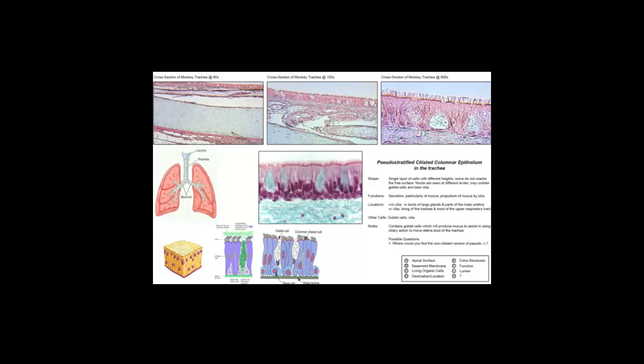Okay, the cells at the basal membrane, or the basement membrane, the basal lamina, since this is a mucous membrane, would be more cuboid-like because they're mitotically dividing, they're younger, and they haven't quite reached the size and the quantity of the colloid cytoplasmic material within them as a mature cell would have, seen here.